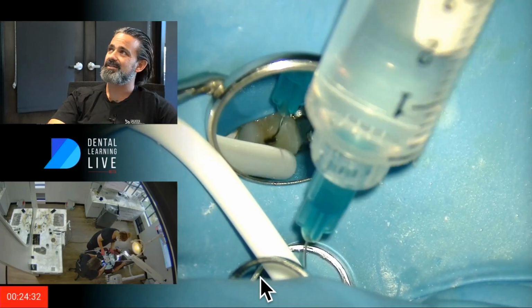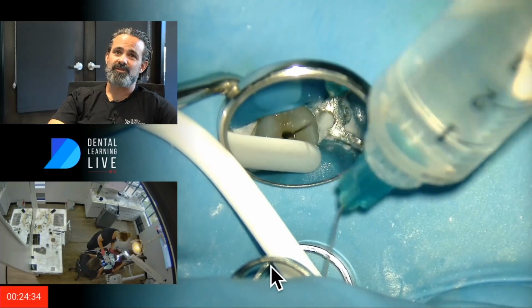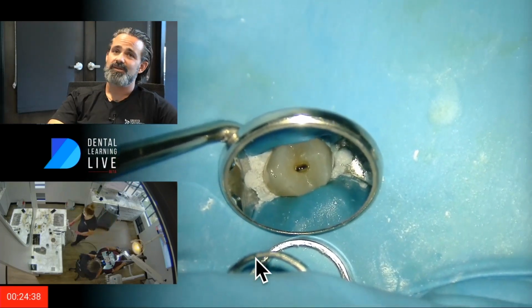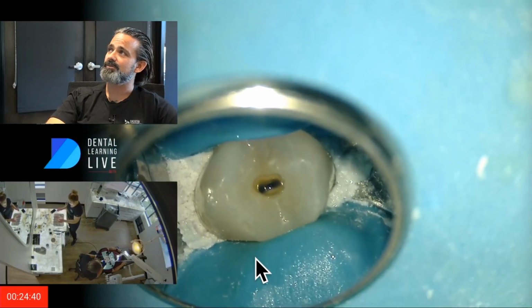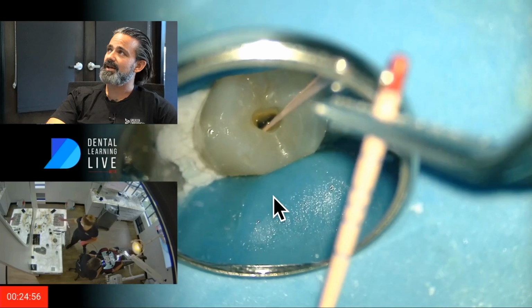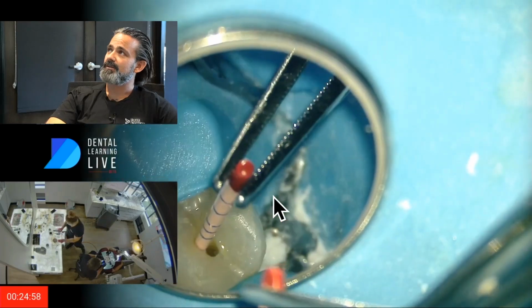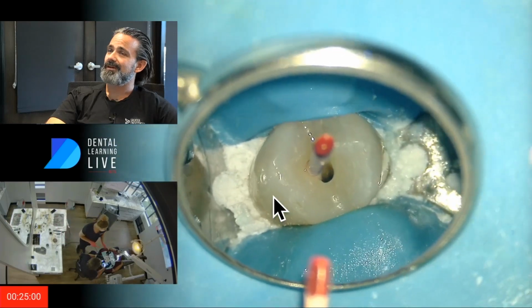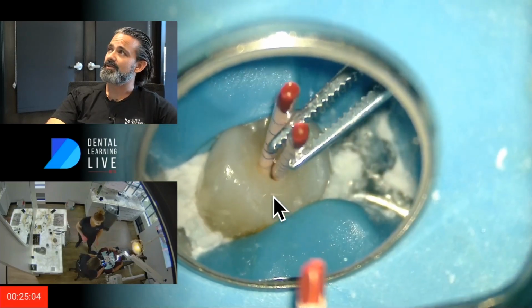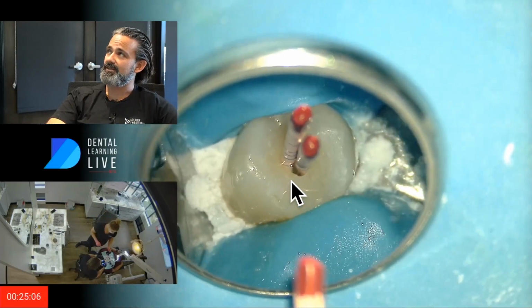I haven't liked the traditional clamps or the single bow clamps on bicuspids or anteriors as much, but that's the drawback to the mesial bow. So we can see really small access. Could always go smaller, I get that, but small for GentleWave. Conservative, and you can see that 2 cones are touching.